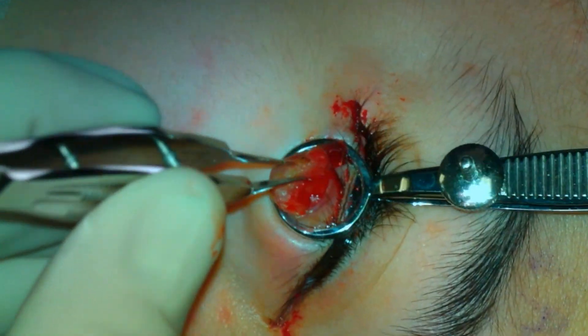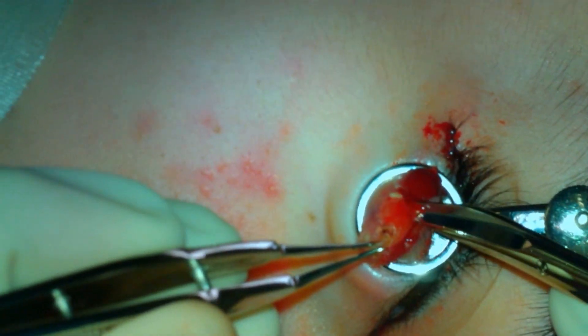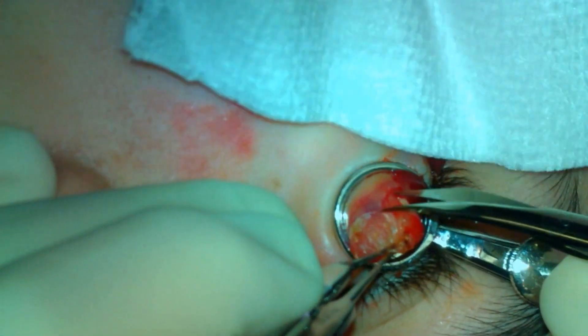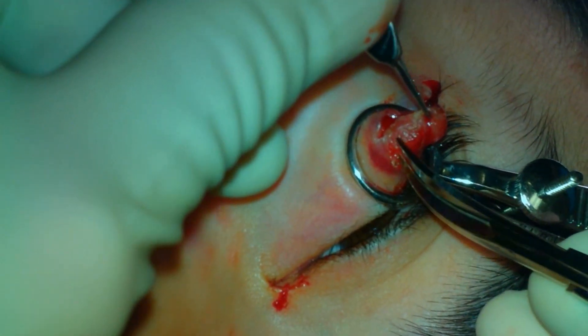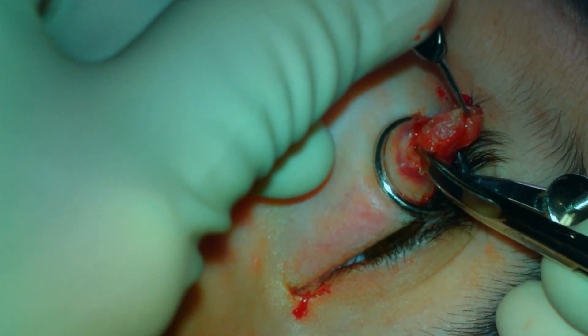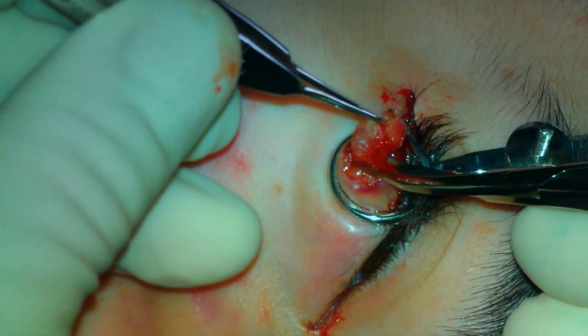I always worry about resecting this amount of skin, but I have been pleased with the way in which the wound heals. Realistically, you cannot address this lesion without sacrificing some of the skin overlying the lesion. The superficial portion of the lesion is removed and the remaining portion is then addressed with the chalazion curette.